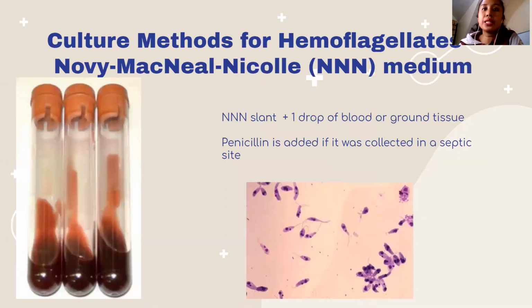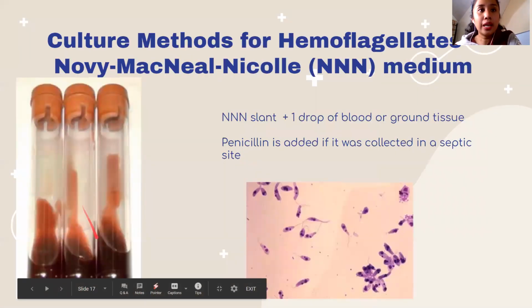Okay, and class, ito yung lumalabas sa board exam. NNN, Novy-MacNeal-Nicolle Medium. Yan. So, it's for the diagnosis of hemoflagellates. So, Leishmania, Trypanosoma, class, NNN. So, class, it's a slanted agar. Yan, slanted agar. Slant siya.